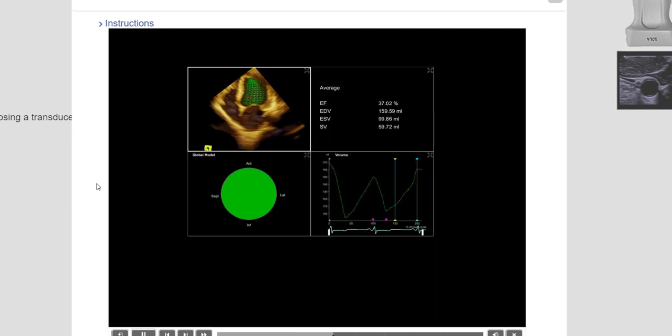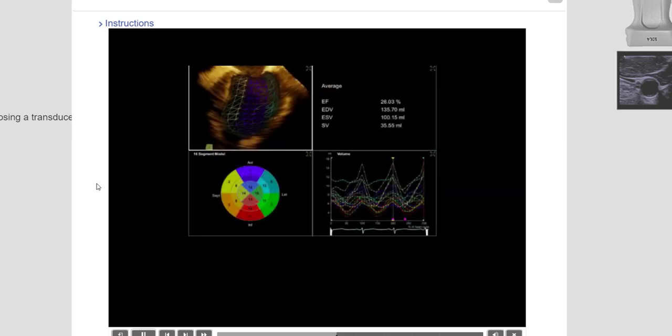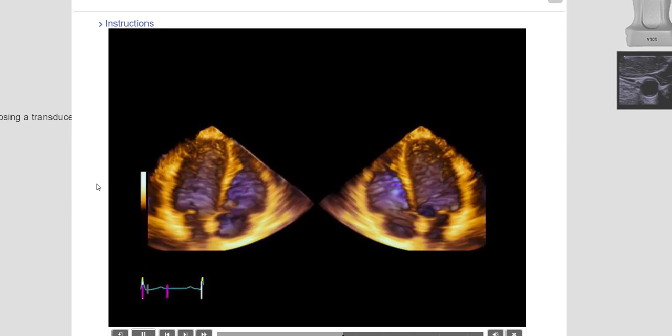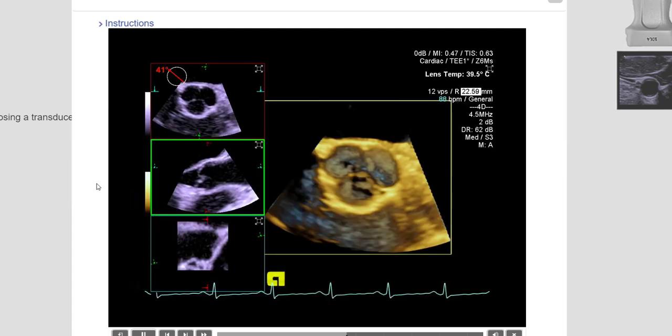For cardiology applications, there are volume transducers that create real-time, full-volume data sets. TTE and TEE transducers are used in cardiology applications to produce real-time volumes of the heart chambers for quantitative and qualitative valve analysis. Both the transthoracic and TEE create an FOV that is multiple layers. The layers have the two-dimensional depth and width collected across the thickness of the beam over the cardiac cycle, time.